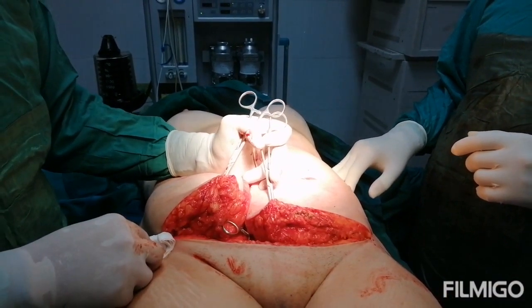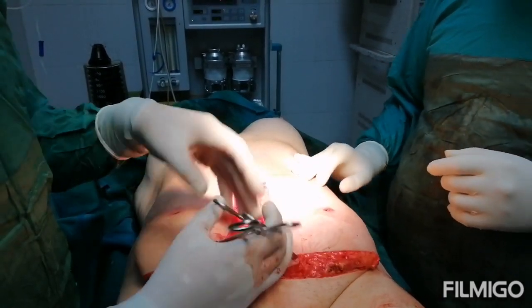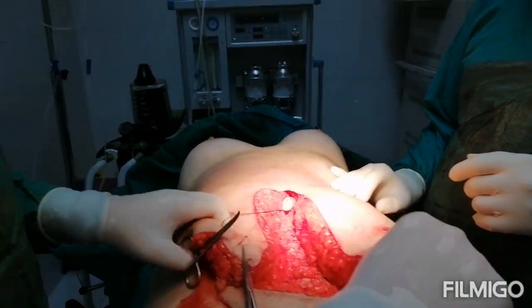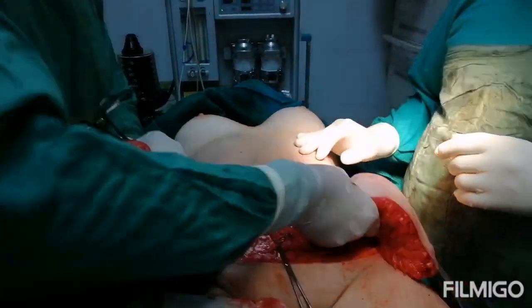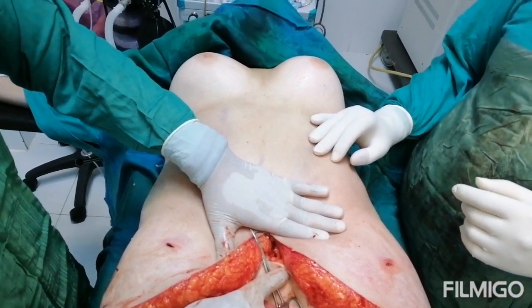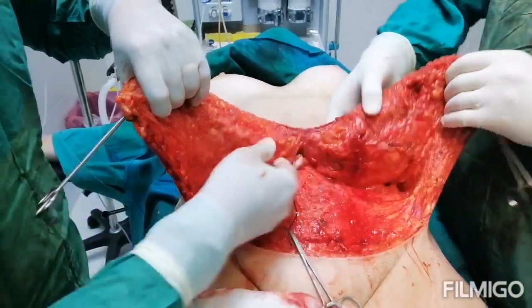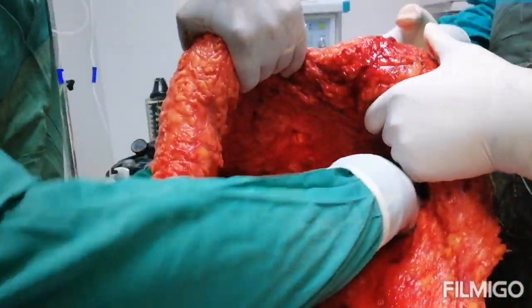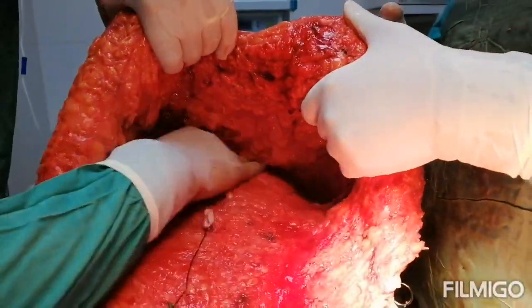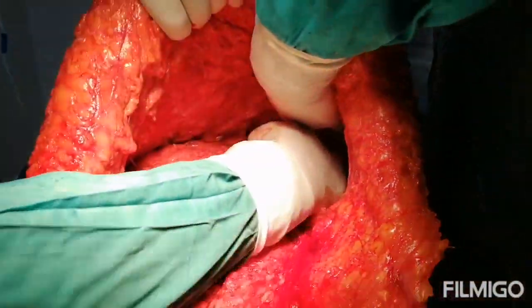Now this is the incision of the tummy tuck where we made the dissection here. We remove the umbilicus here and separate it. As you can see, with the tummy tuck you pull this down so it goes like this. After that, we make a pocket inside this section and hold the section up to both sides. Then we go to the breast where we make a pocket for the muscle — under the muscle.